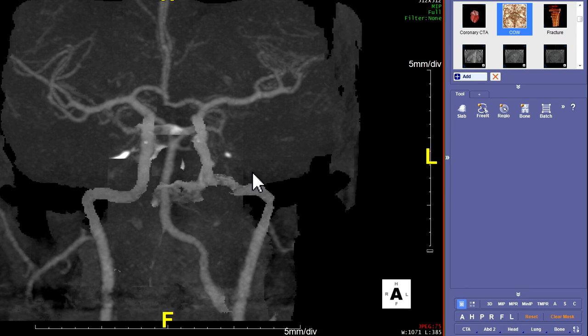So we showed how to make the 3D COW with bone, then we used the automatic bone removal tool with Neck1 to make a 3D COW without bone, and then we just changed it to MIP Full to make a MIP COW. We should have five series that we sent, and we could send those to PACS. And that is all.